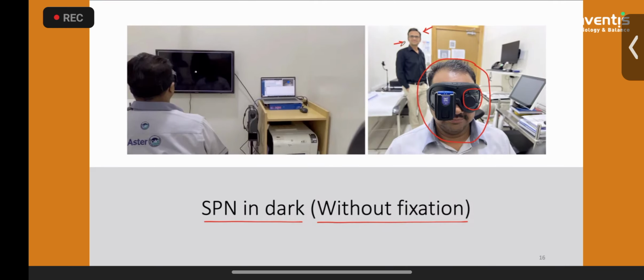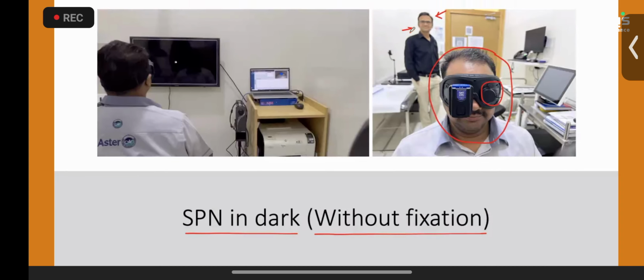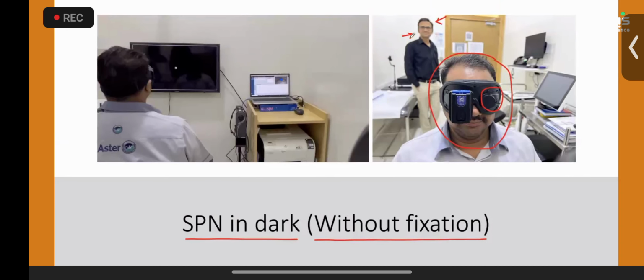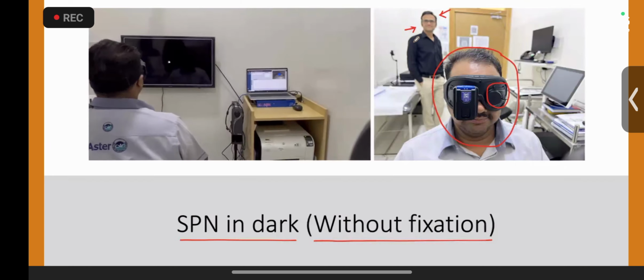That is because only the screen is on the fovea and parafoveal region, and the other parts you are able to see are in the peripheral retina. So that's why my image is blurred. That is in the peripheral retina, and in the photographs also we can see the blurred background. So that's a peculiarity of this photograph.